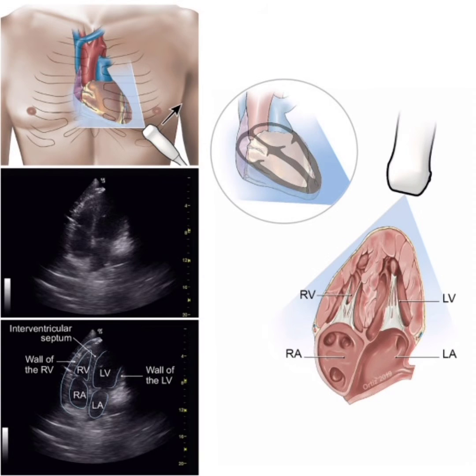See this image. This is the apical 4-chamber view. Probe placed on the 5th intercostal space and marker towards the left side, which is around 3 o'clock position.